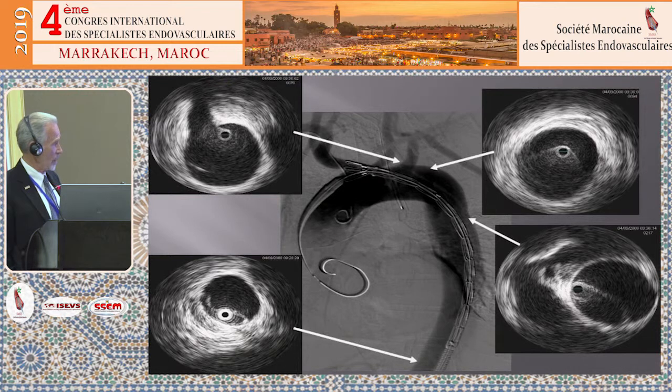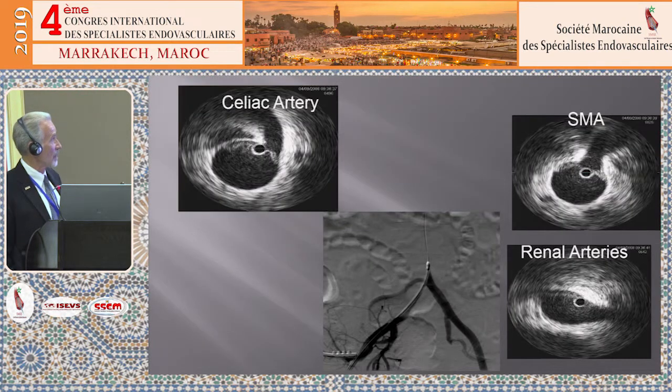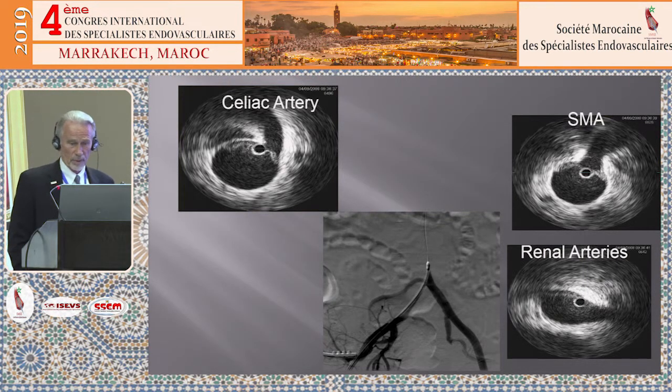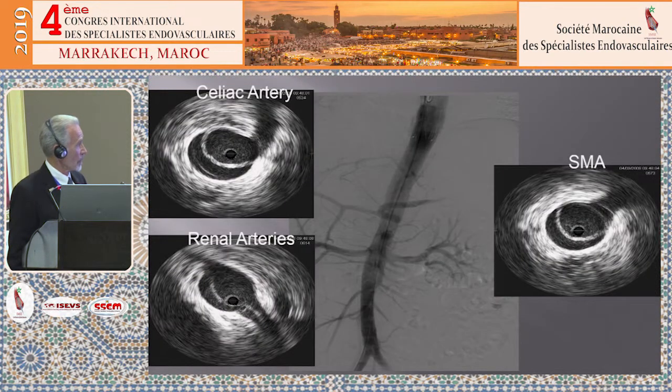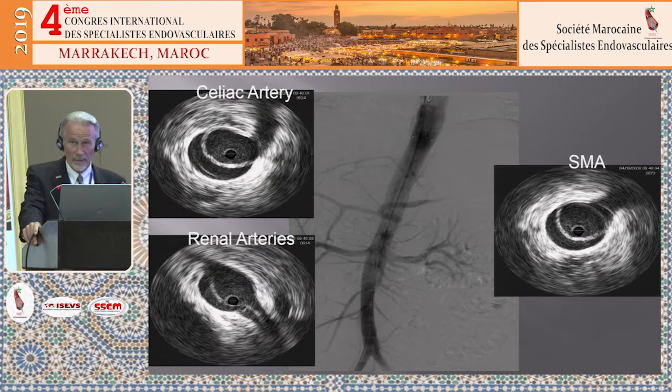And as we come down along the aorta, it collapses up against here the celiac, the SMA, and the renals, and that's why below there's really no pulses with complete collapse. Once we put the endograft here at the subclavian, and then further down, here's the subclavian again covered, you can see that the true lumen opens up here at the celiac, the SMA, and the renals, and so perfusion to the distal vessels where we normally have to operate and open that up is available, and then if there are abdominal findings, to be able to treat that later.